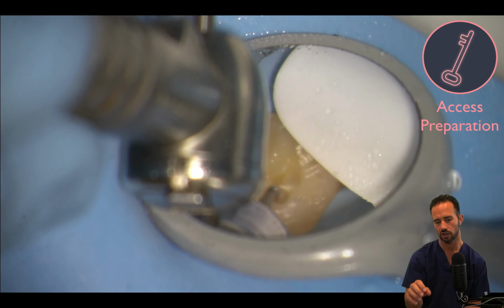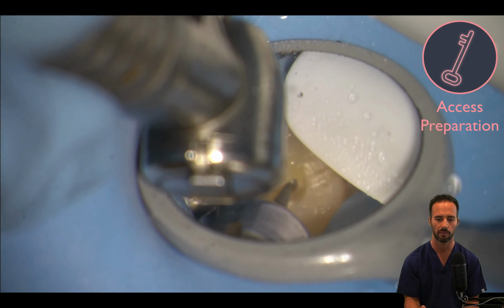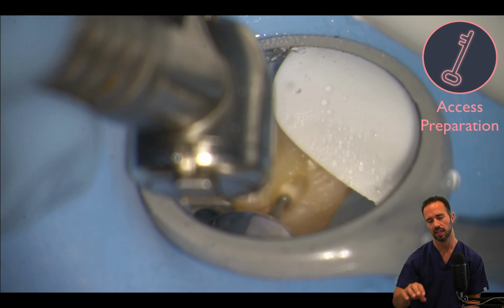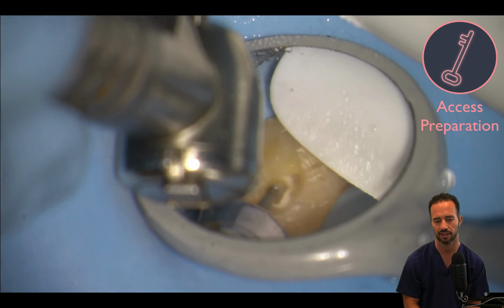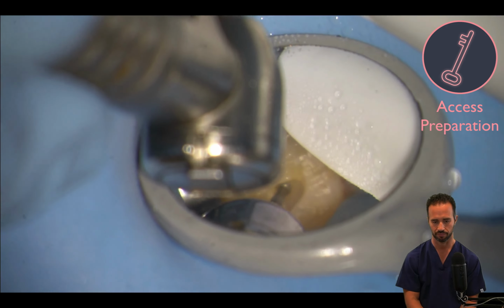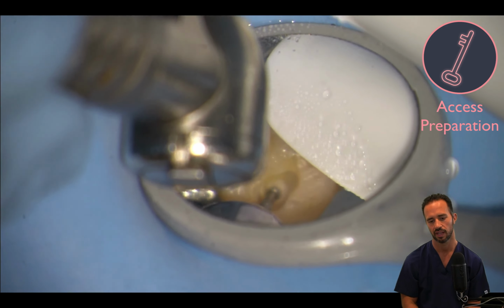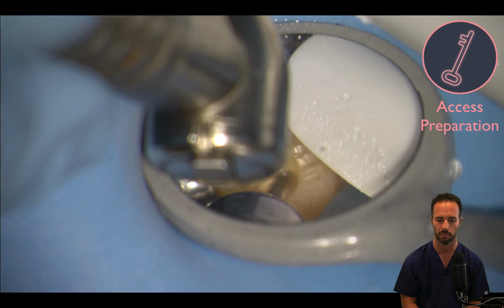So start generally in the area between the oblique ridge and a few millimeters from that marginal ridge as well. And as you know, the access preparation is going to be a rounded triangular form, and so you want to keep that in mind as you're creating your initial shape. And so we're making our way down. Notice it's some nice soft brushing motions, creating our general outline form of our access preparation.